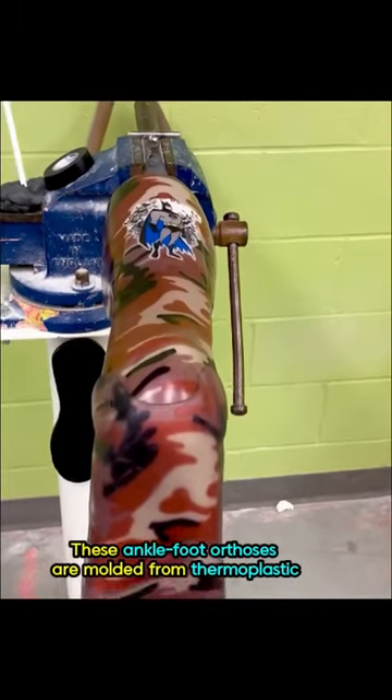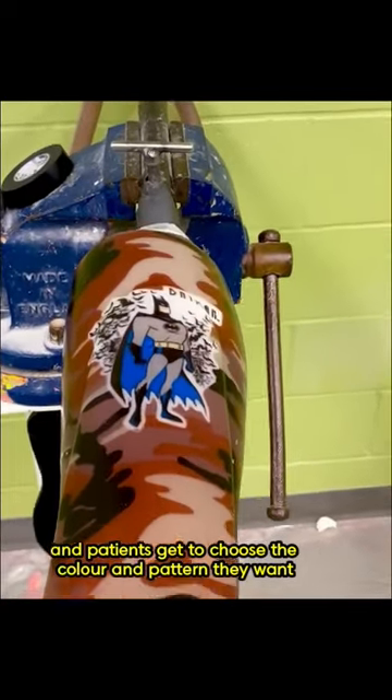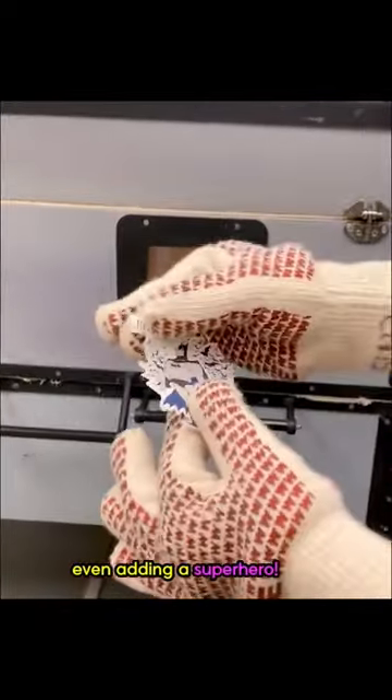Today, I'll be shadowing an orthotist. These ankle-foot orthoses are molded from thermoplastic, and patients get to choose the color and pattern they want, even adding a superhero.